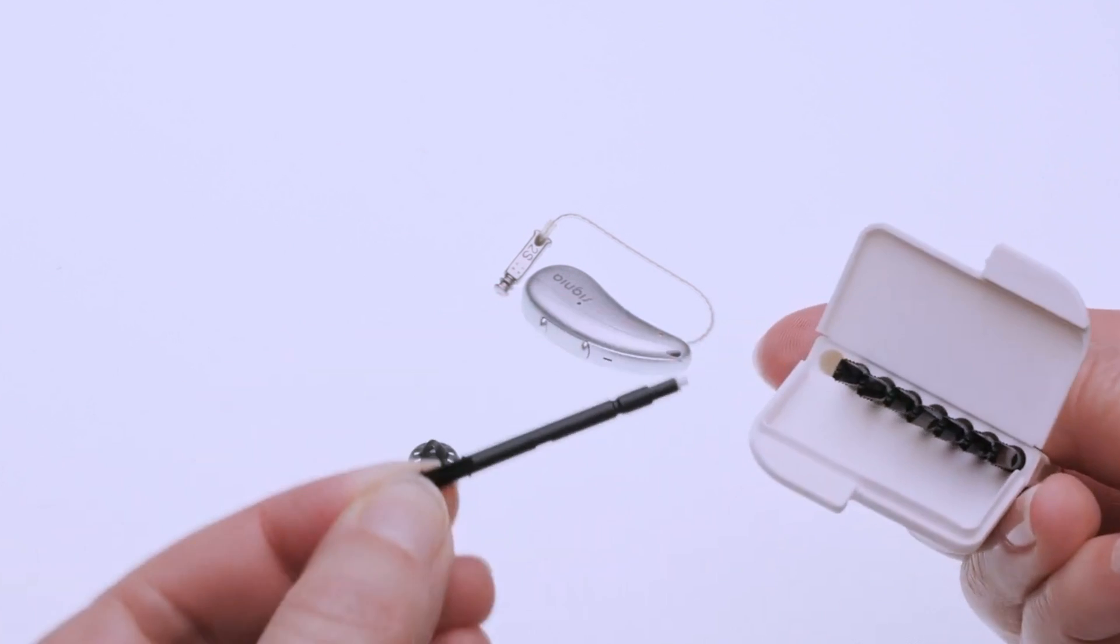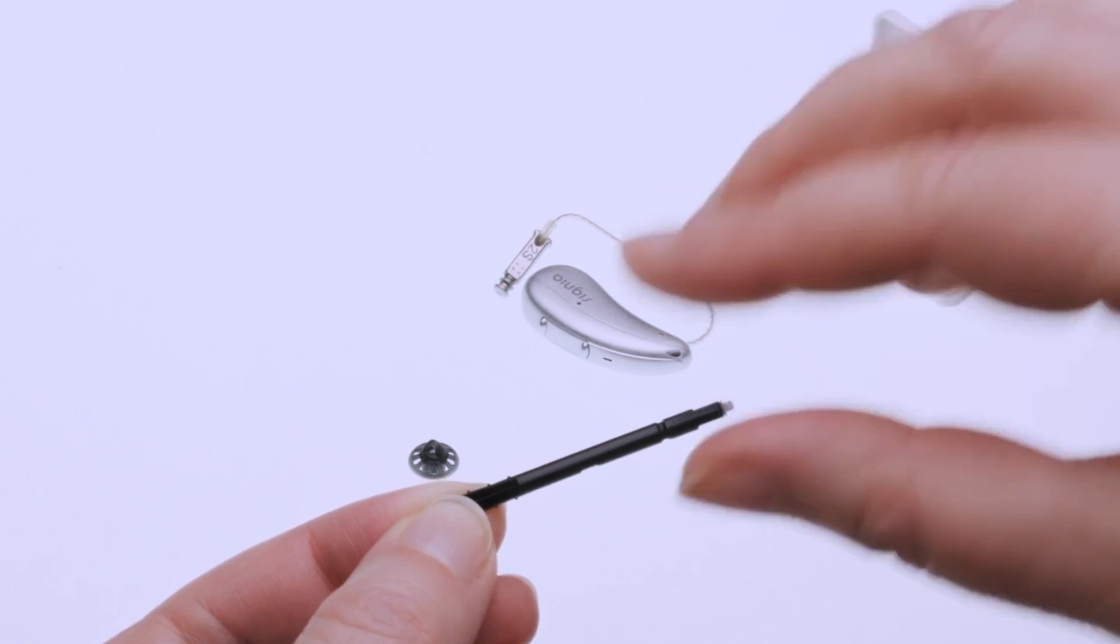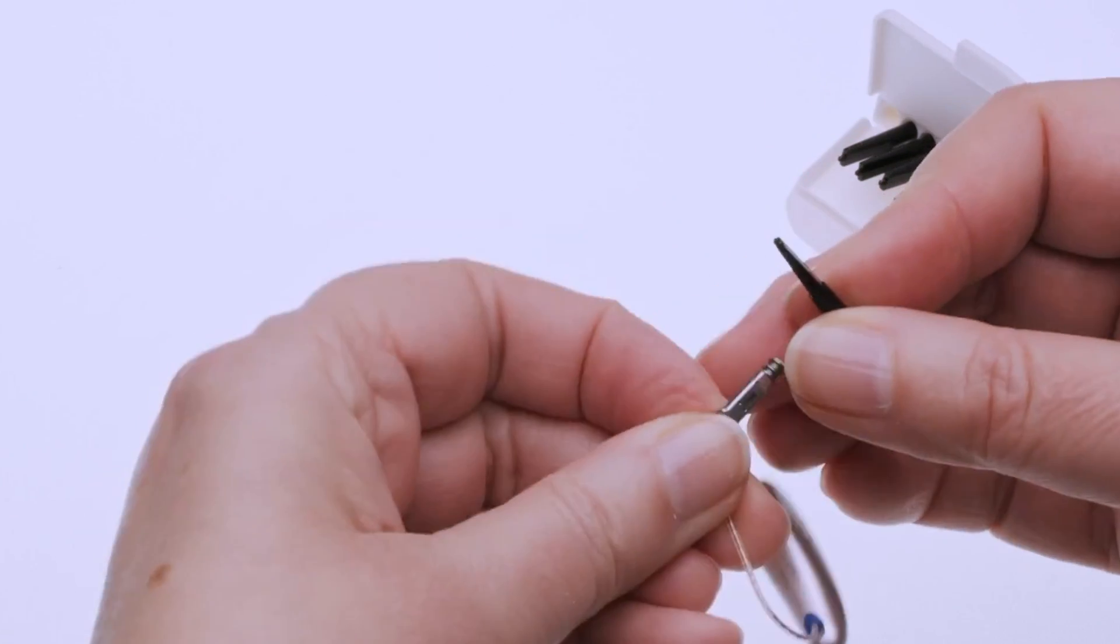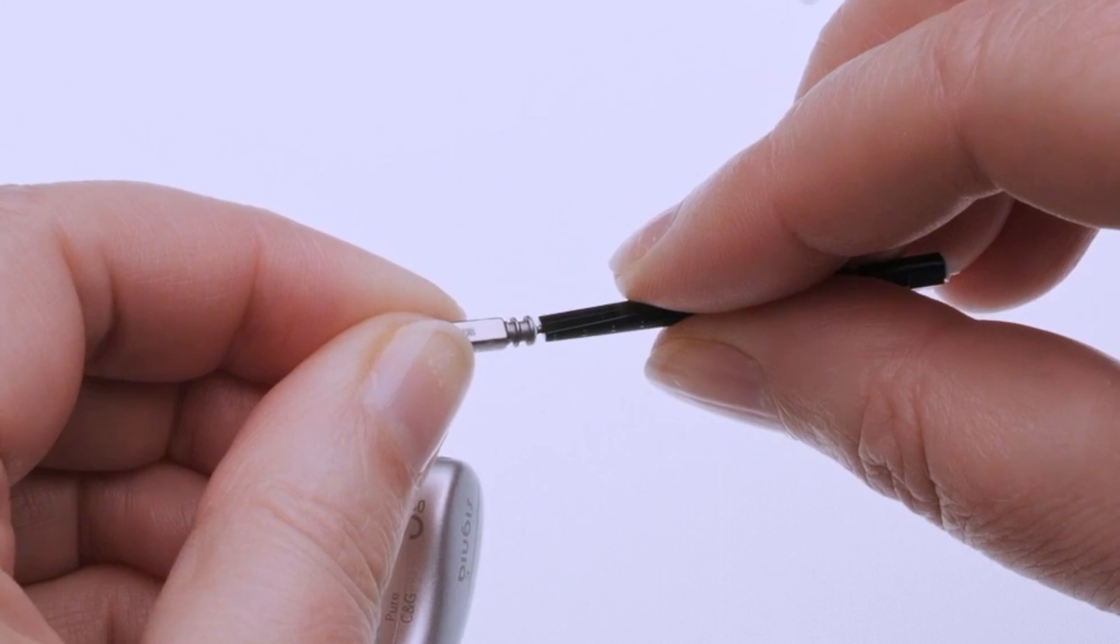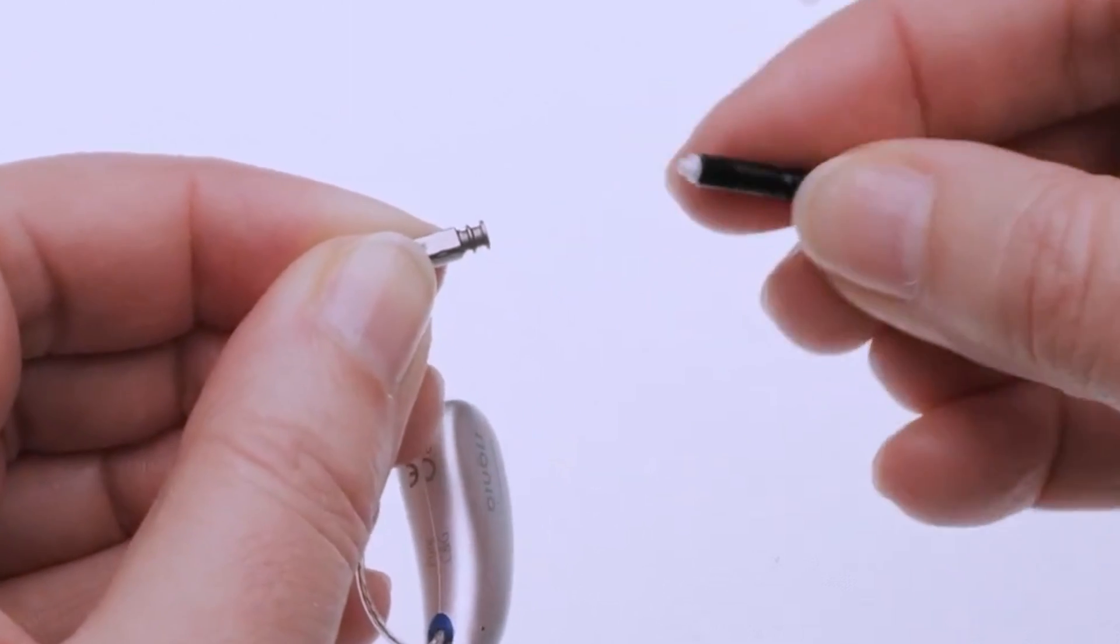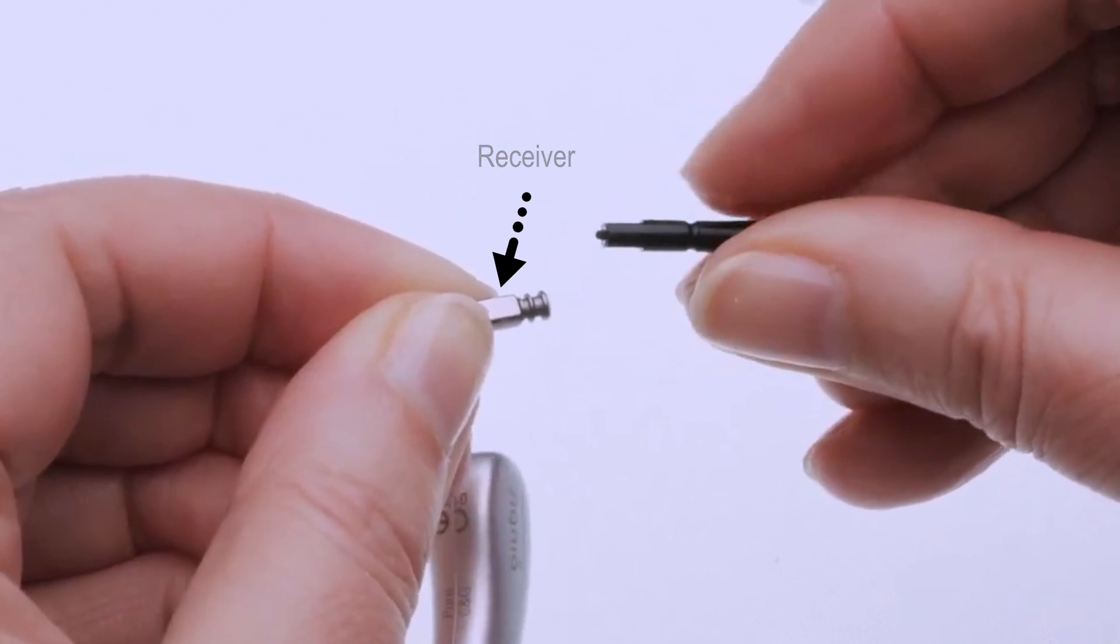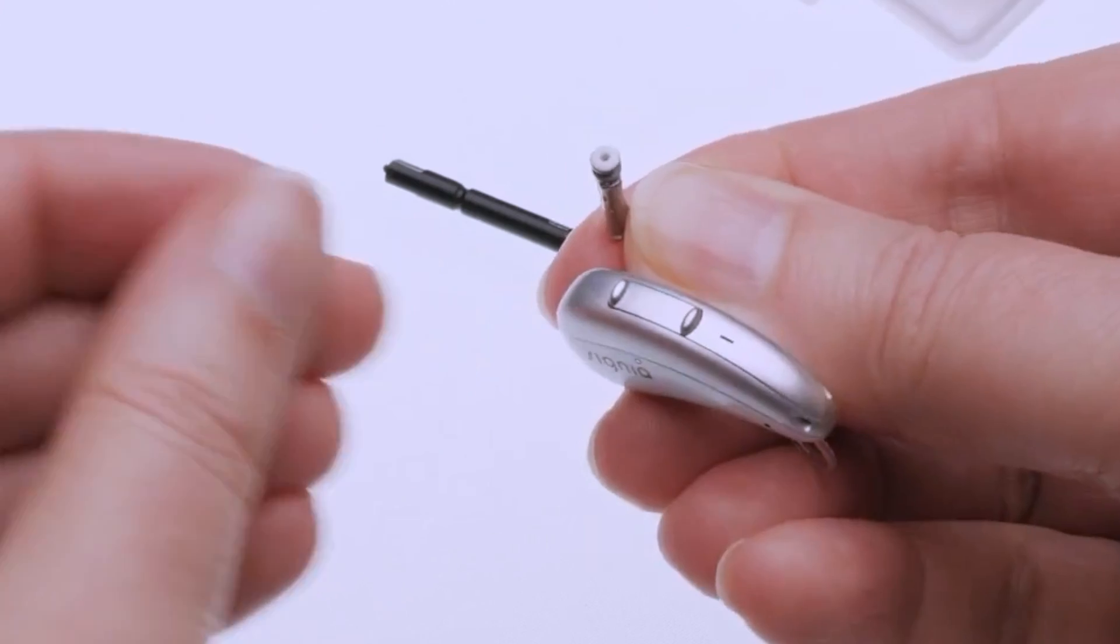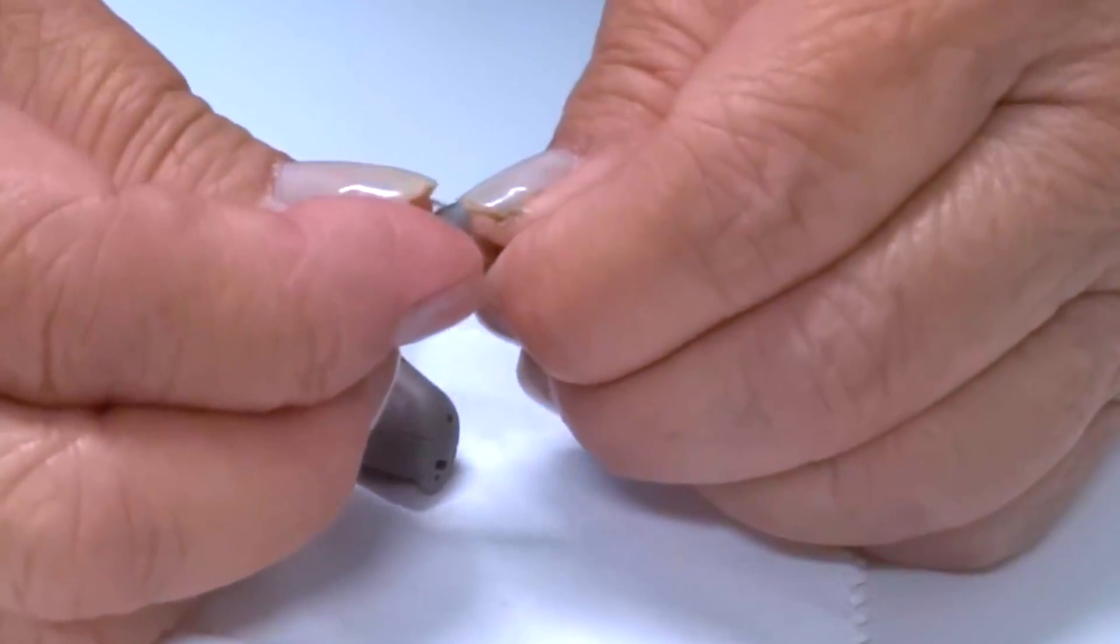Here is another demonstration of replacing the wax guard on a different hearing aid. After replacing the wax guard, gently press the hearing aid dome back over the receiver.